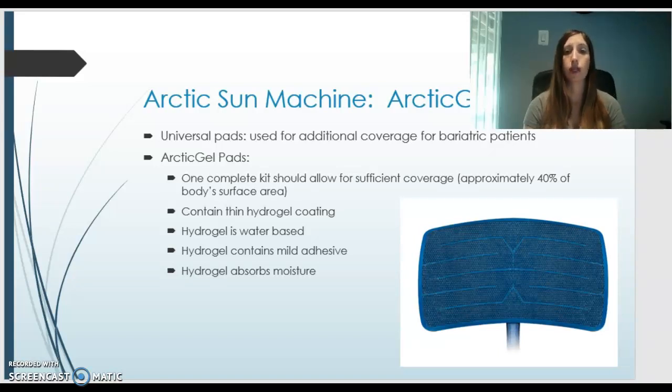which is also a plus for skin. While the pads are on, you must inspect the skin every 4 hours by just peeling back the pads and inspecting the skin and then documenting your skin assessment.